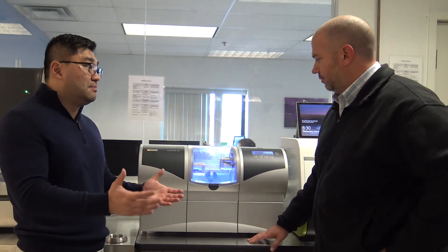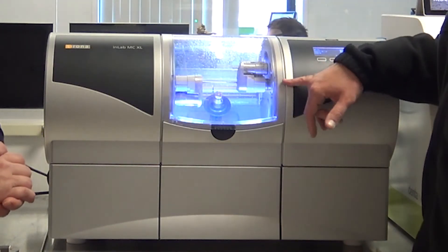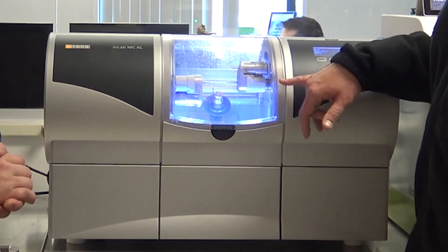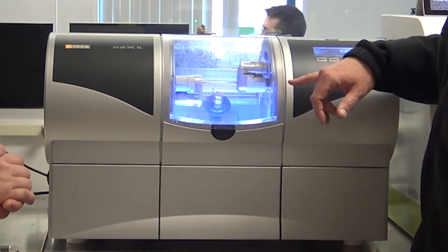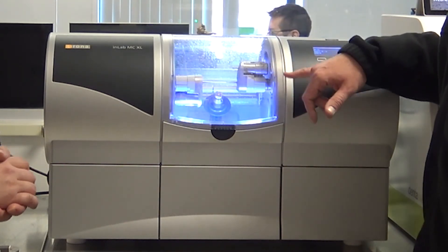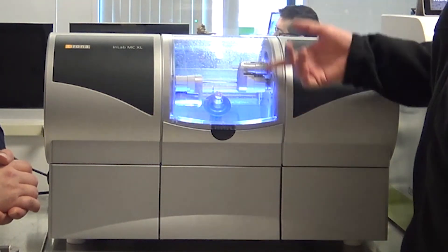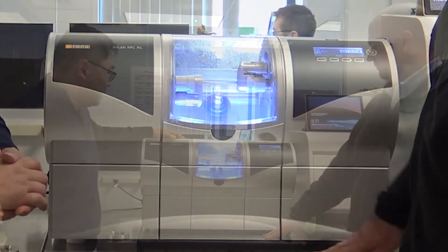And you're not always using all the burrs though, right? If you're not using the fine milling? Correct. It has two burr sets and it uses one burr set at a time. So let's say you're only milling Emax or Seltra in it — you can put the 12S burrs in both sets. So if a burr gets worn halfway through a mill, it'll automatically switch to the other set and continue to mill as well. Very neat.